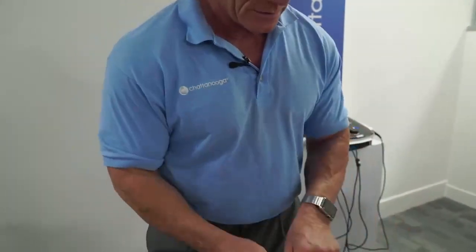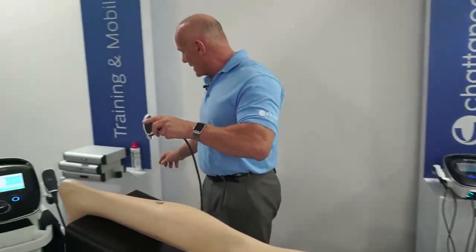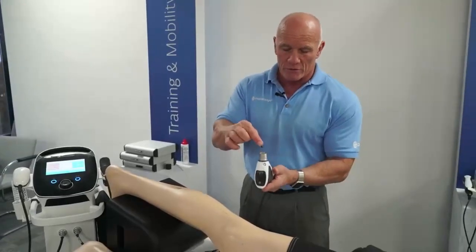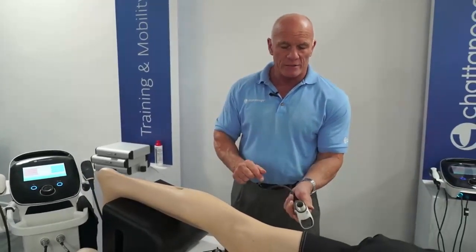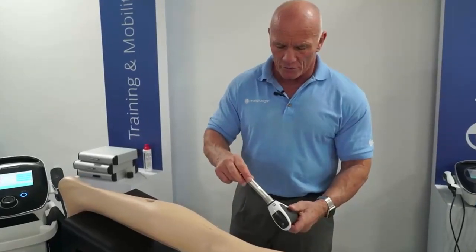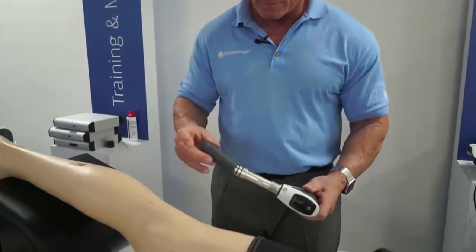The transmitter, you tap out and throw away. You get a new transmitter, which you simply drop into place in there, and then screw it back together. All right, put your handpiece back on.